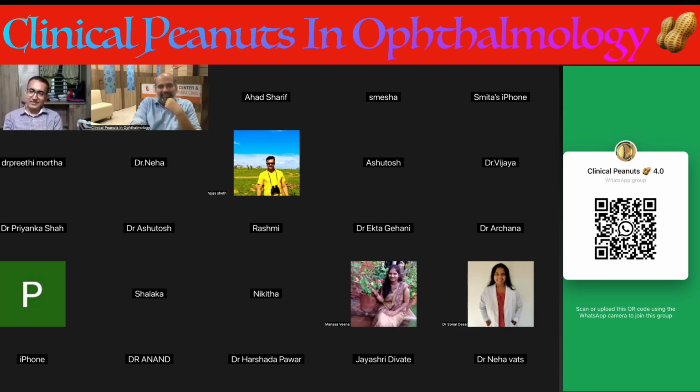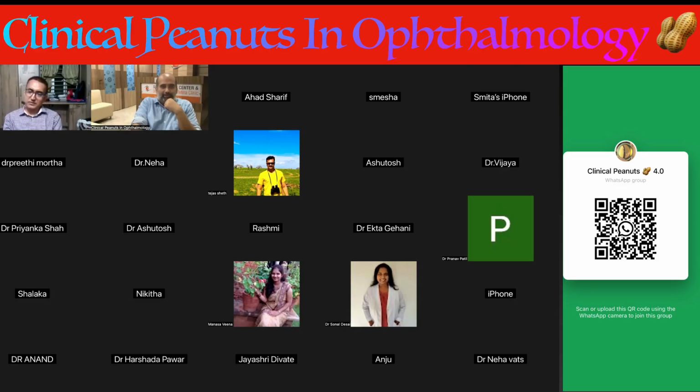Okay, so how to manage more than 6 diopters of astigmatism? Yes, you can think of 6 diopters with the IOL, and if slightly more, then try to do LRI or a nomogram. If it is more than that, then of course you can look at Care Group. They are providing up to 10 diopters. Or you can think of some piggyback lenses. Some of the companies are coming with them.